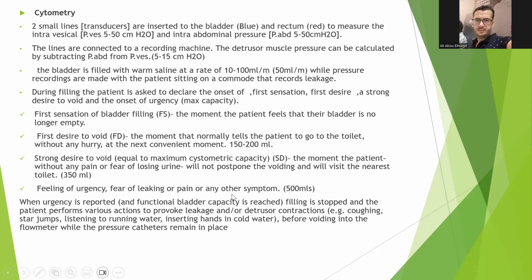Feeling of urgency: the patient cannot postpone anymore. She needs to wee right now. Urgency corresponds to the maximum capacity of the bladder, normally around 500 mils.